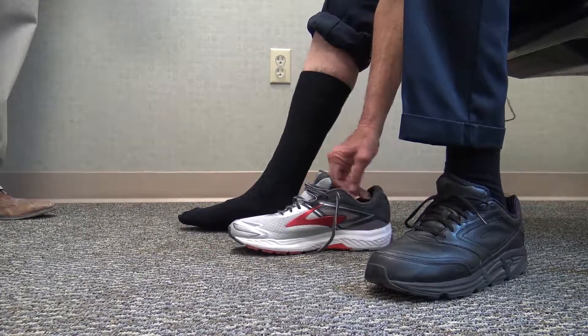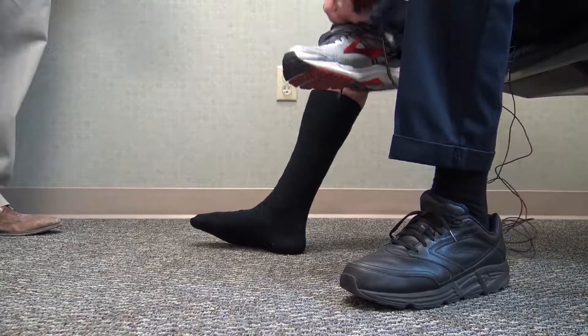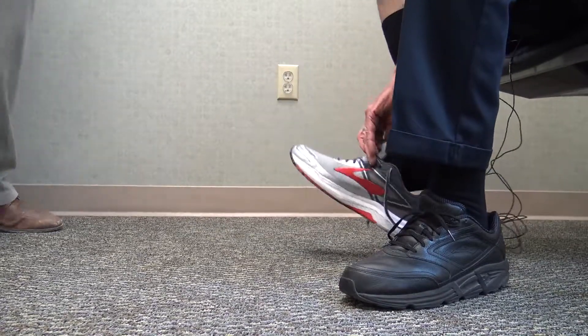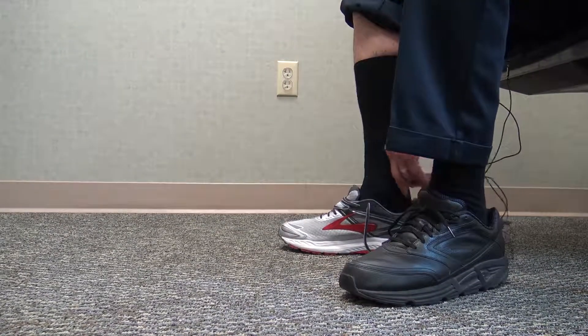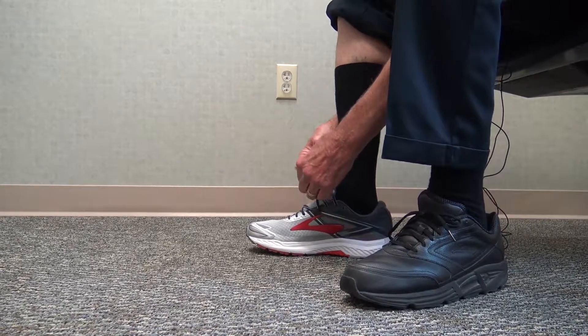When you put the orthotic in the shoe and put the patient's shoe on — now if they're post-op, they may have to get a size or two bigger because of the swelling of the ankle if they've had fixation. So they put the shoe on with the orthotic.